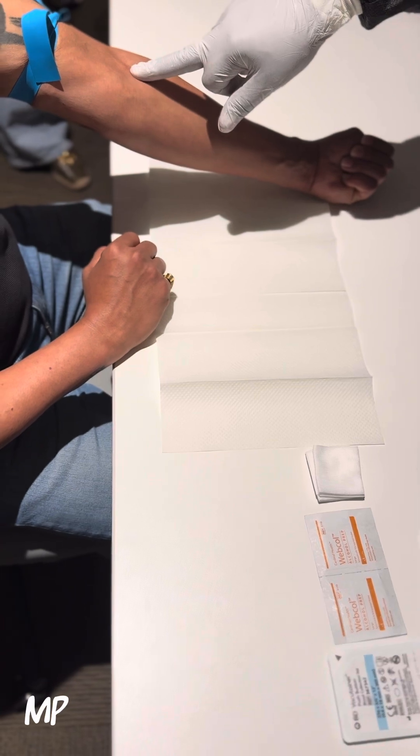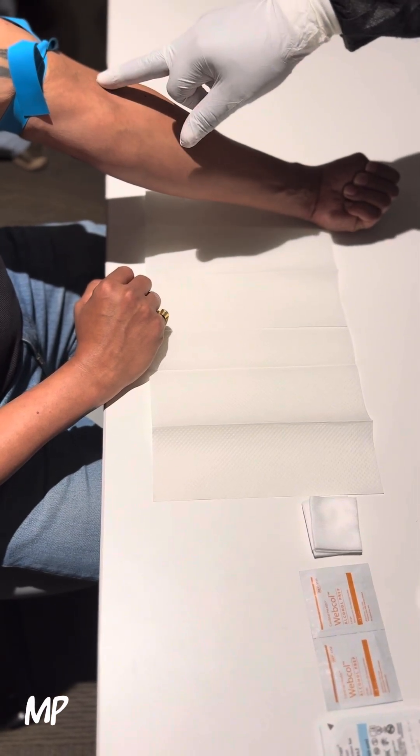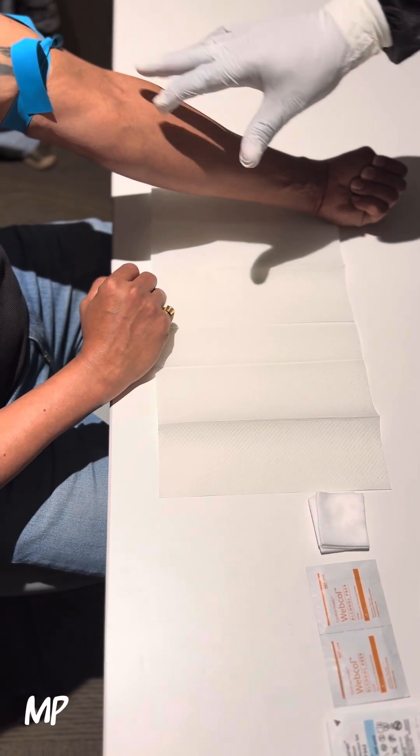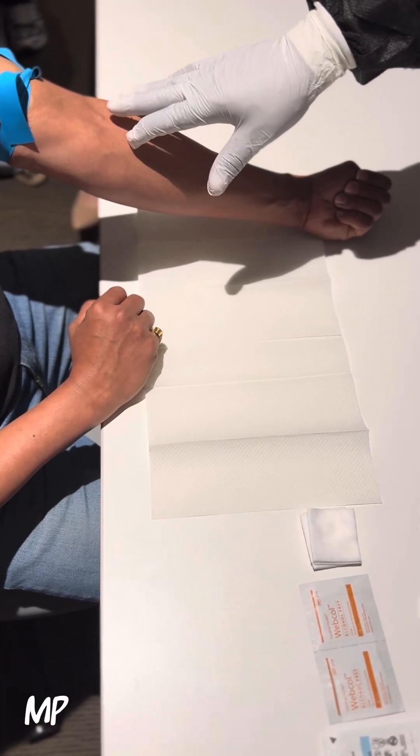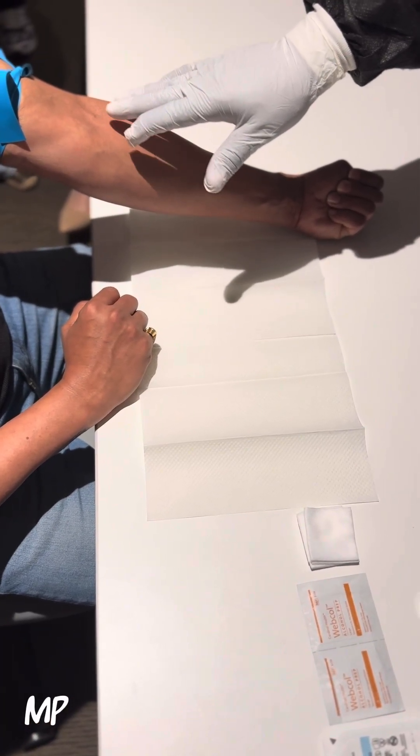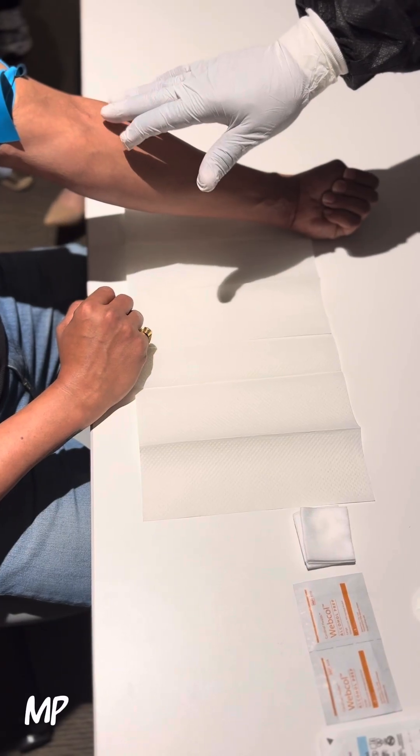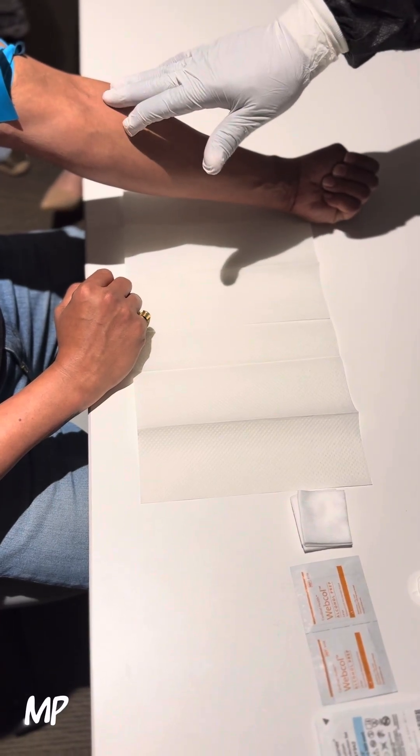We performed a venipuncture there earlier, but we're going to go above the previous venipuncture site. When you're performing a venipuncture on the patient, you can utilize the same vein twice. You just cannot use the same entry point, so you can draw the blood above or below the previous site of incision.